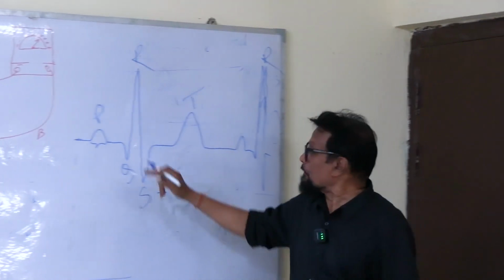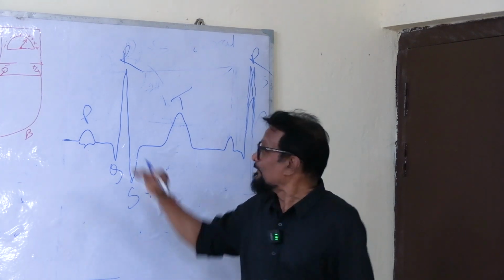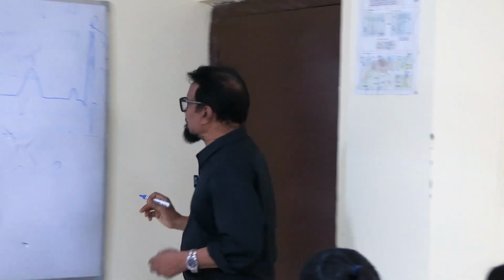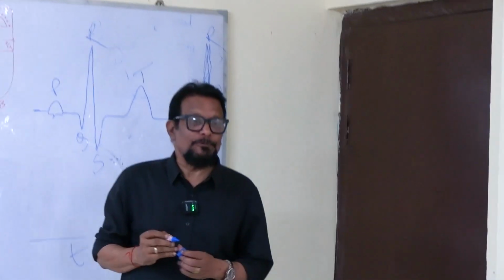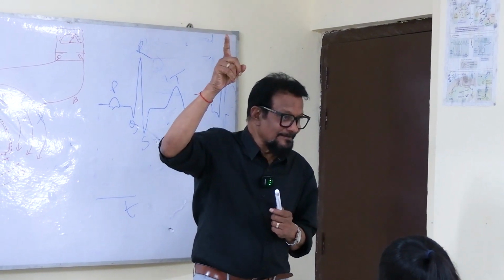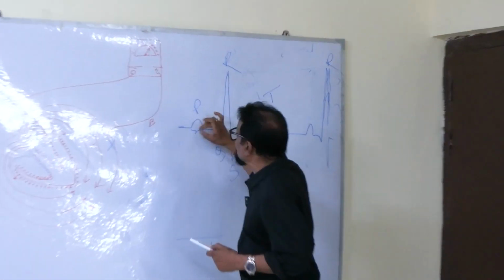This wave is a positive wave, this is the baseline. Over the baseline, so it's a positive wave. And its duration is this. Sir, how will we calculate the duration? And this fluctuation is voltage. How will I determine, sir, what is the voltage of this wave?